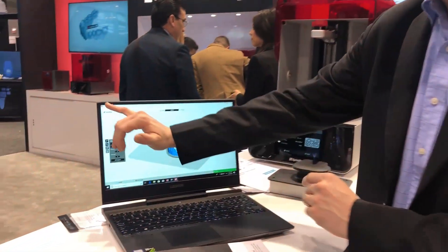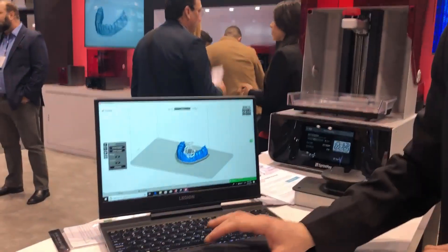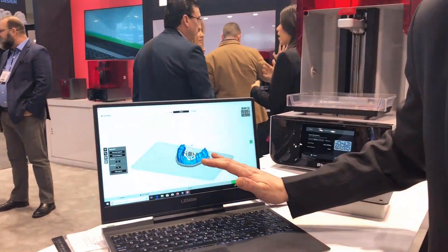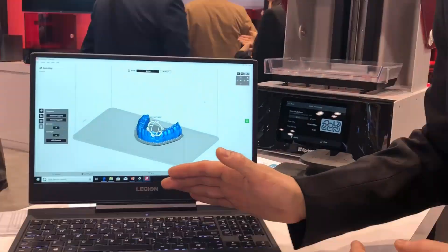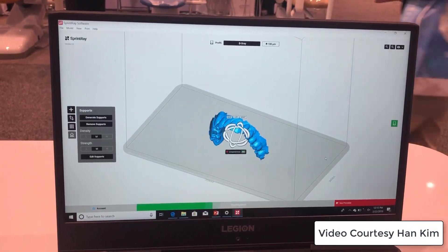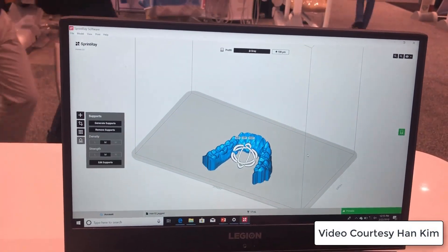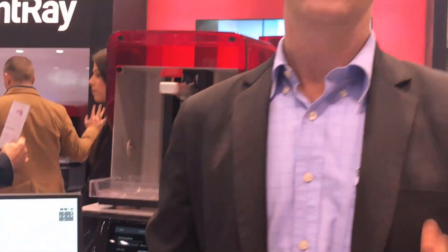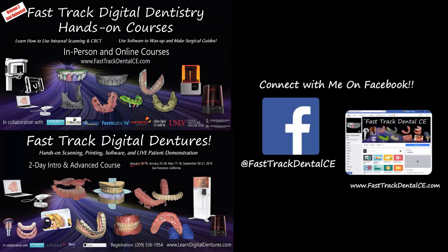If we pull up our Sprintray Rayware software, the neatest part now is they will do an automatic base fabrication. So I pull in a raw STL file, click the base button, and it automatically gets my patient's model ready for 3D printing. There are some incredible improvements here with the Sprintray system, and I'm very excited to see where this is going.